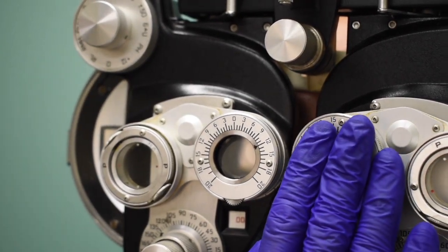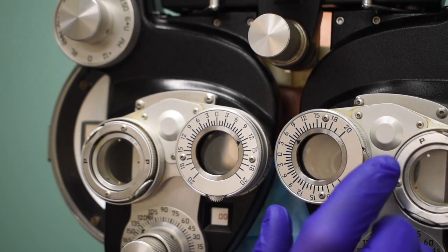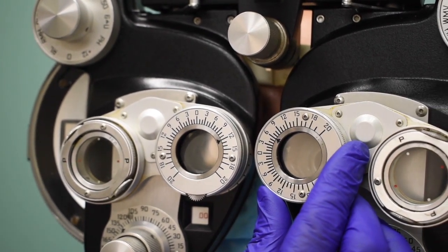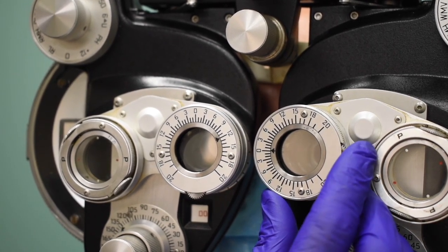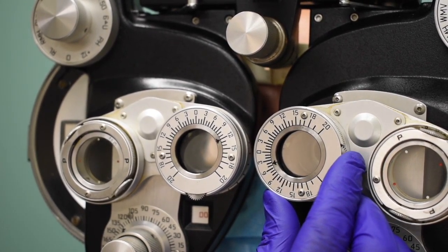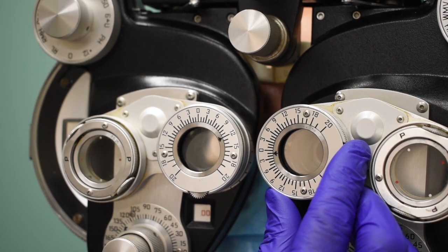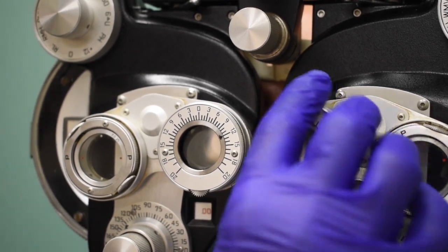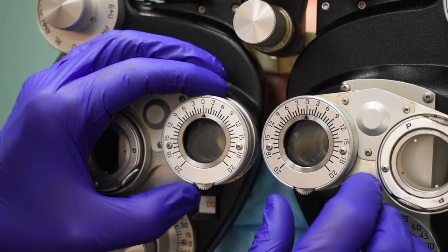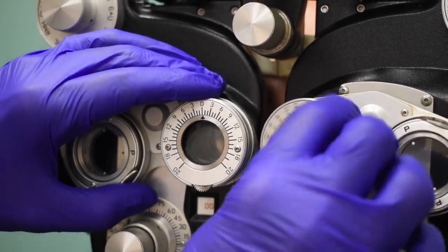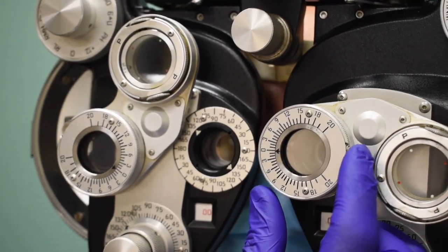Watch the top one now, Phoebe. Watch this one right here. Keep it as clear as you can. Tell me when they go side by side. Now. Good. I'm going to go past. Tell me when they line up side by side again. Now. And 0-0 on the vertical. I'm going to get it all set up again here. We'll go ahead and do our vertical vergences.